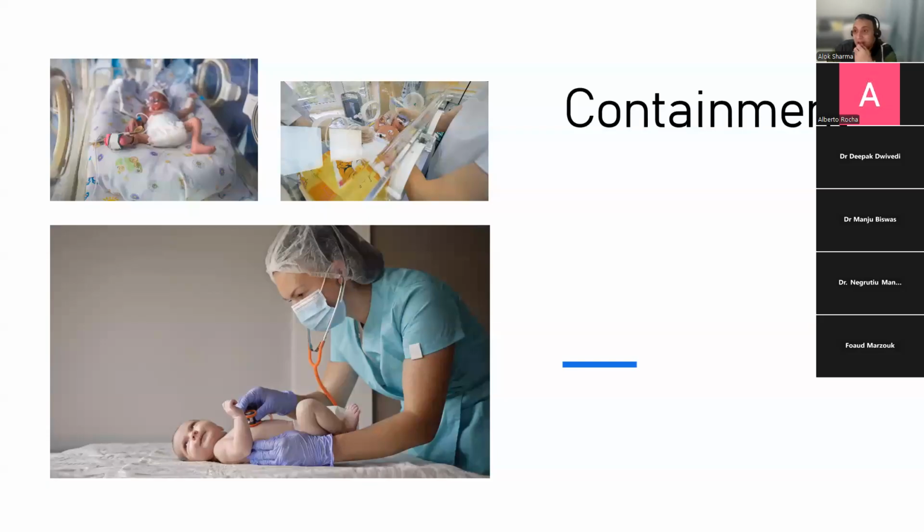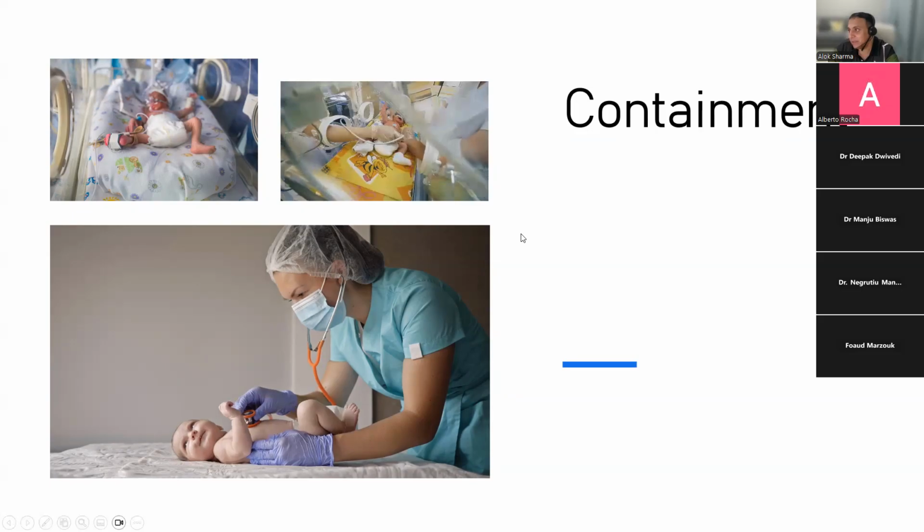is a little bit of give and take. It's really about having a little bit of a contract and speaking to them about times that are convenient for them and then looking at the baby's stability. But I can't emphasize enough how important this concept of containment is.